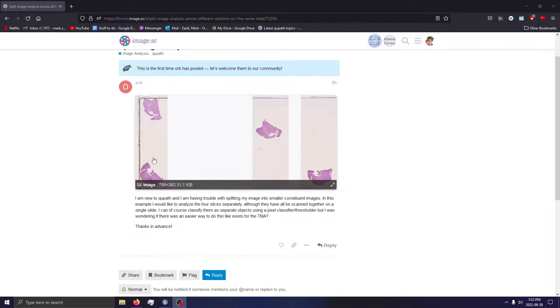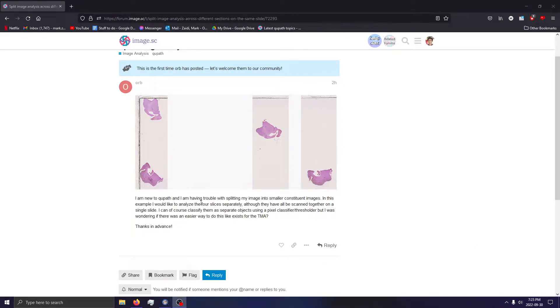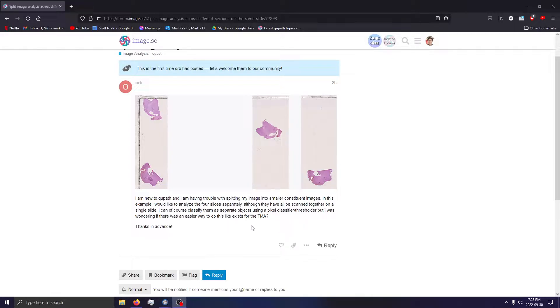The purpose of this recording is to answer a question posted on the forum. The question is: 'I am new to QuPath and I'm having trouble with splitting my image into smaller constituent images. In this example, I would like to analyze four slices separately, although they all have to be scanned together on a single slide. I can classify them as separate objects using the pixel classifier, but is there an easier way to do this, like exists for the TMA?'